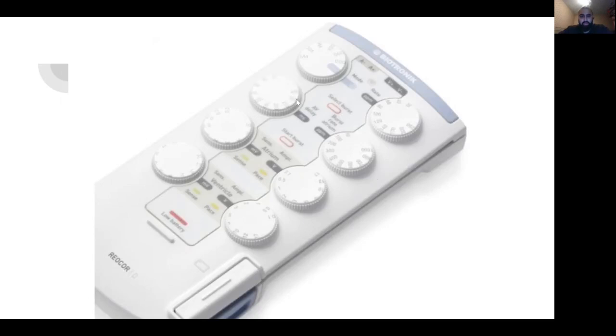This is the AV delay, which I talked about. And this is to be used when we're using DDD mode. That's when you will set the AV delay. And the reason why you may vary the delay, because you may wonder, well, we have a normal PR interval of 0.2, so why would we ever have a higher AV delay?